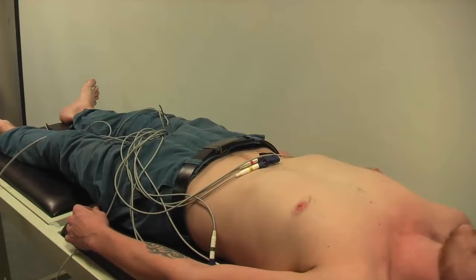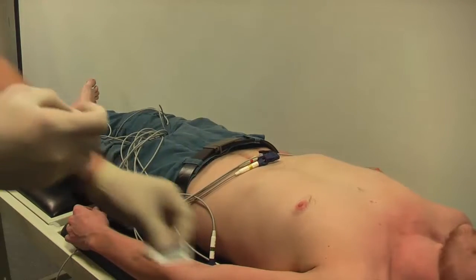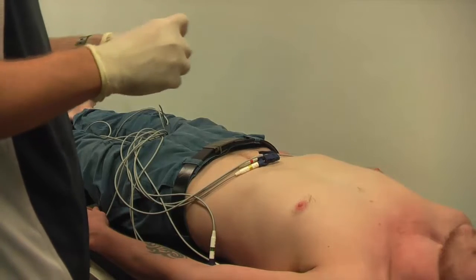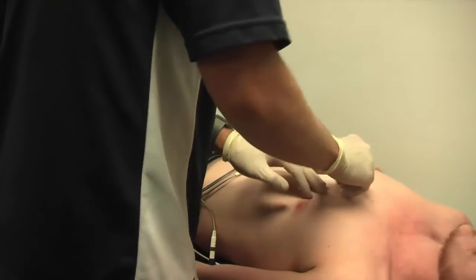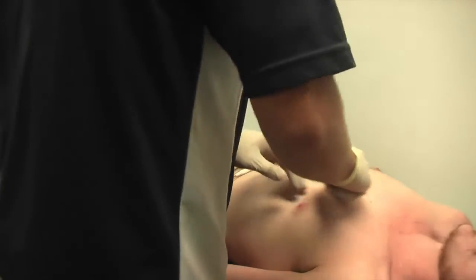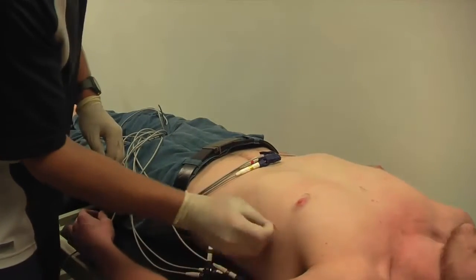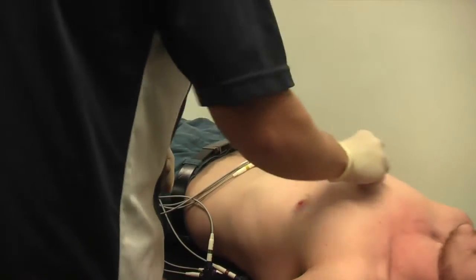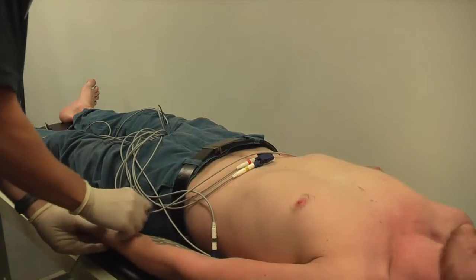We're going to be prepping the patient correctly before we place the electrodes, ensuring that the electrodes are pushed down for a good second each time they're in place. This will heat up the gel using the practitioner's finger and allow the gel to become fluid, so it's able to move into all the micro-crevices on the patient's skin, giving a lot better trace and a lot better adhesion.